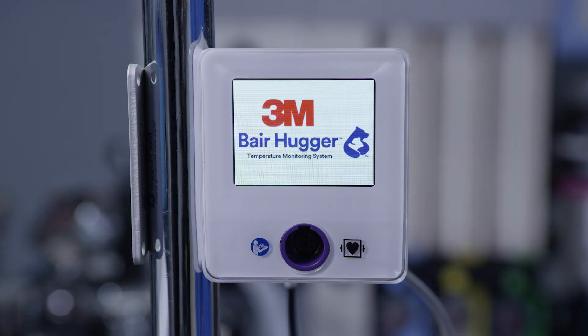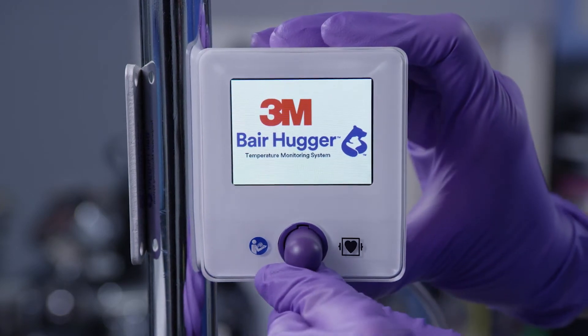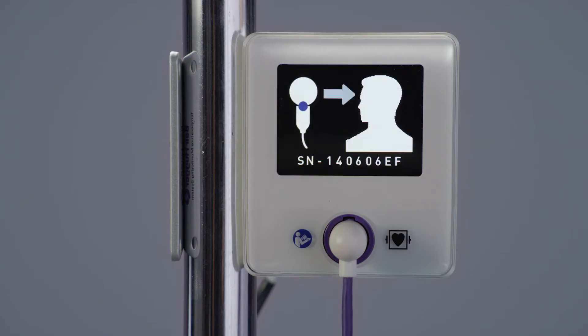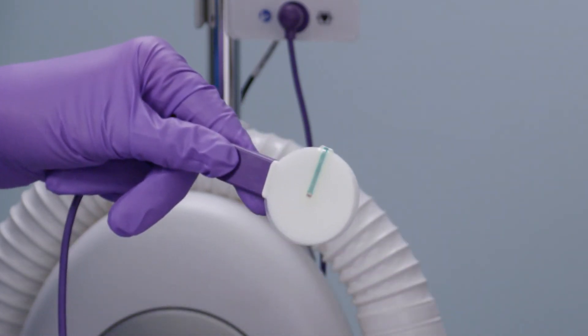You will see the control unit screen illuminate to the standby screen. Connect the sensor cable to the front of the control unit. Use an alcohol wipe to clean and disinfect the patient's forehead above the orbital ridge, and allow the forehead to completely dry. Connect the sensor to the sensor cable connector and ensure the sensor tab is fully inserted. The display on the control unit will change to the ready screen once it confirms the sensor connection. Remove the backing liner from the sensor to expose the adhesive. Do not bend the sensor when removing the backing liner.